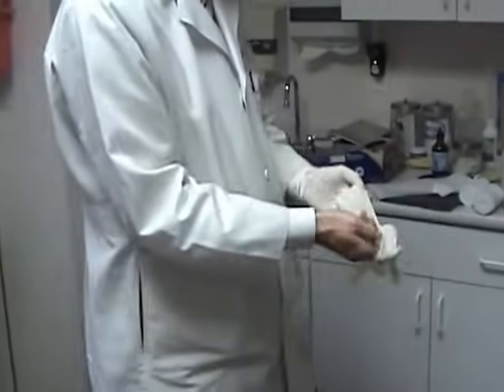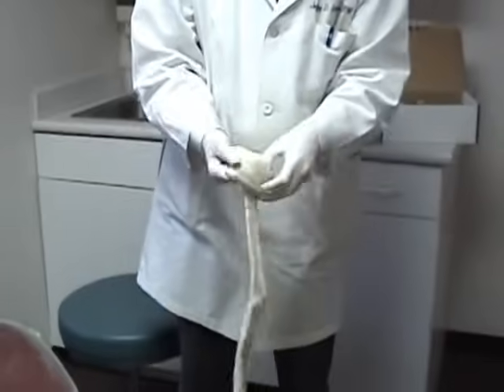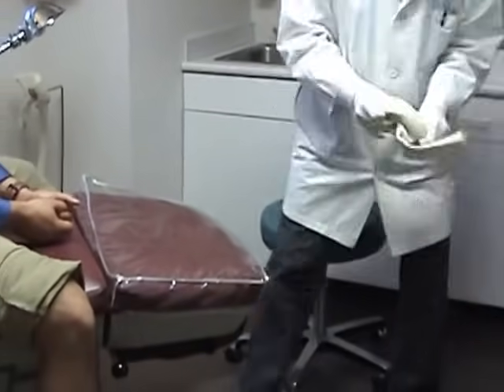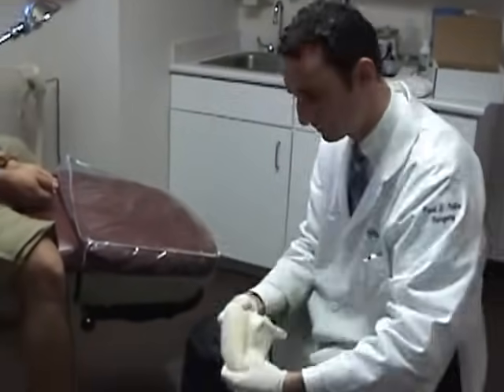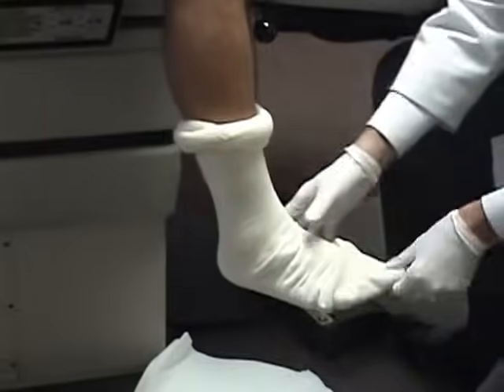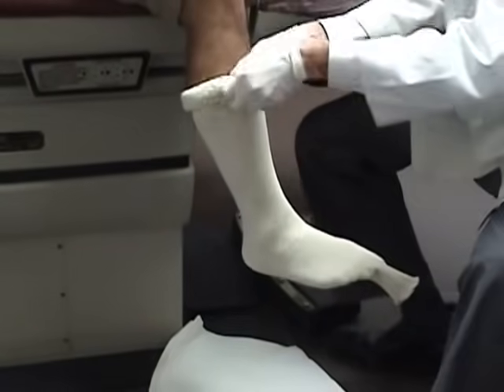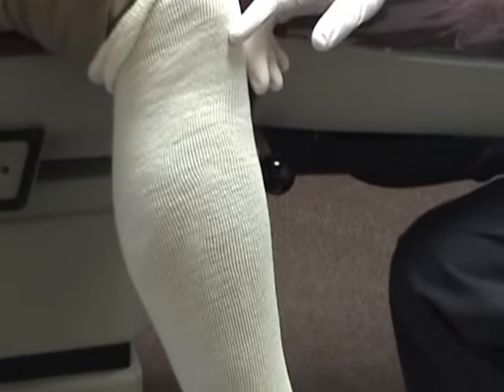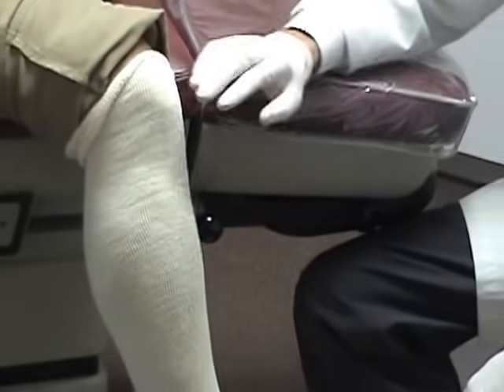The first step is to apply the stockinette. We're going to roll it up, which makes it much easier to put on. Giving it a good stretch makes it even easier. It's important to leave a little excess hanging off the tips of the toes, which we'll address later. When applying the stockinette, make sure there are no wrinkles — we want this nice and smooth. Roll it all the way up; it's important to be at least one inch above the tibial tuberosity, which we clearly are here.